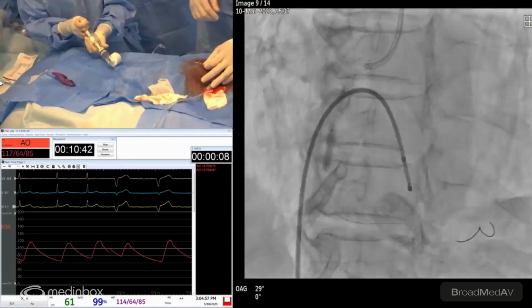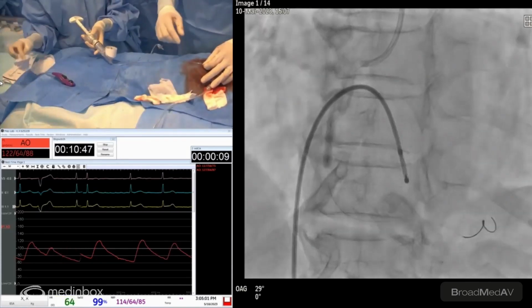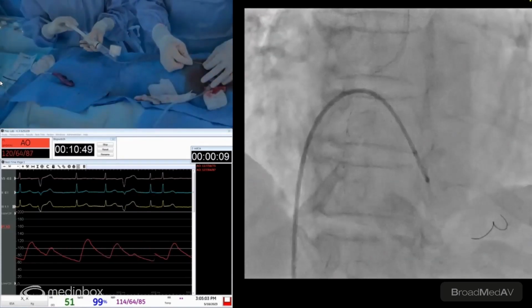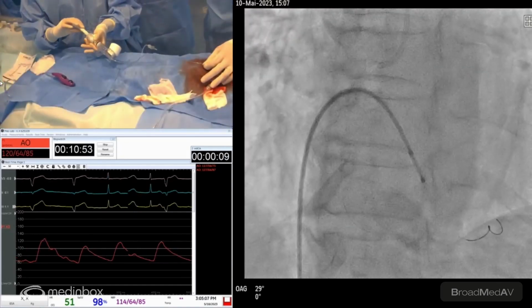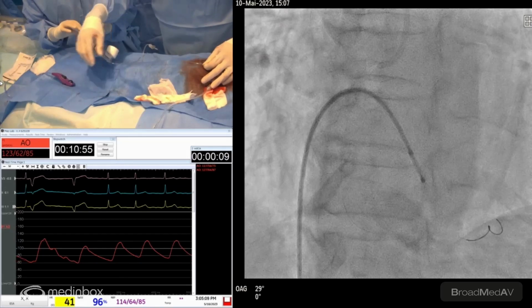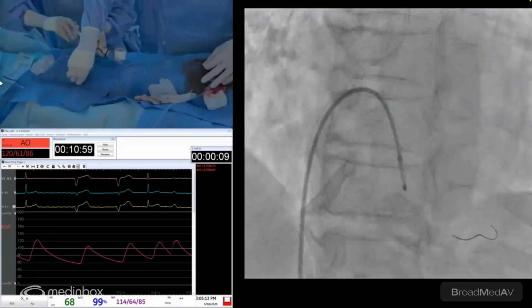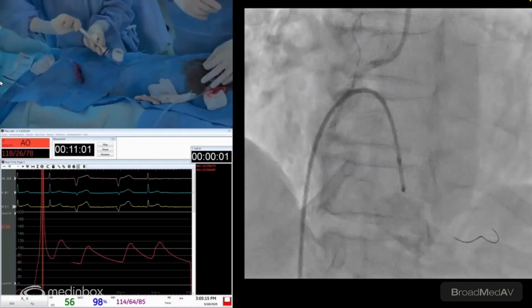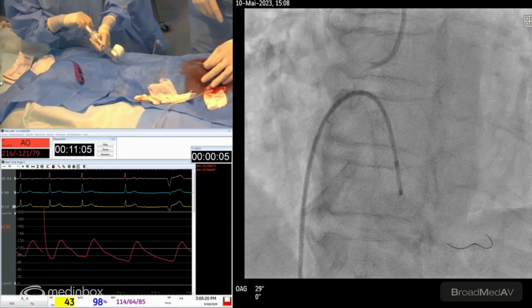Off. So we could use a smaller 3.5 stent for the distal portion of the lesion, and then, well, we can check if we have the Synergy 48, because that would be a perfect choice here, since we know that we need to cover very long. Can you have a look if we have the 48 millimeter Synergy? Ruptured. Stop. If you have it, just bring the box, please.